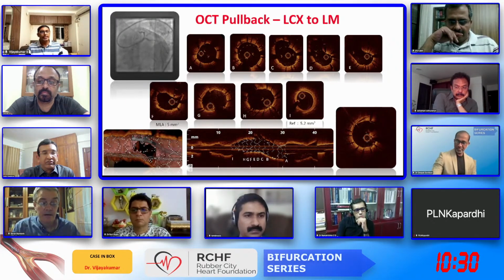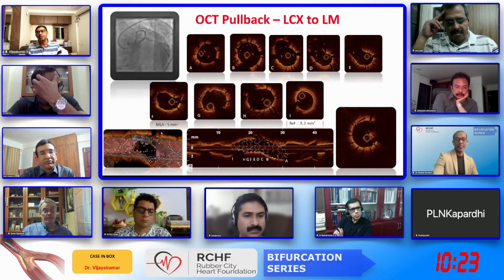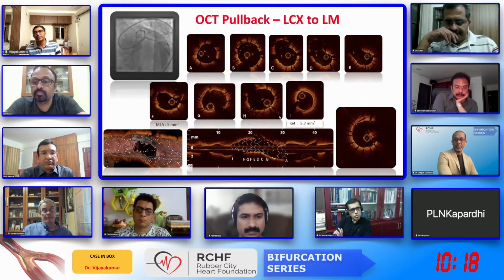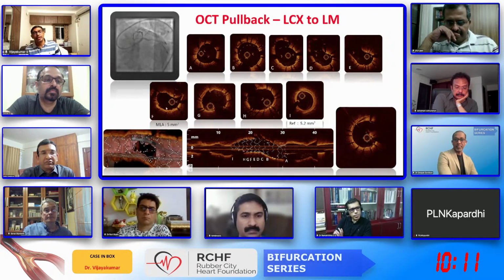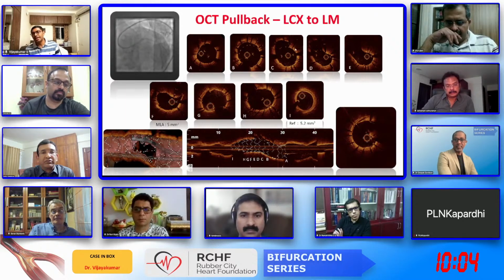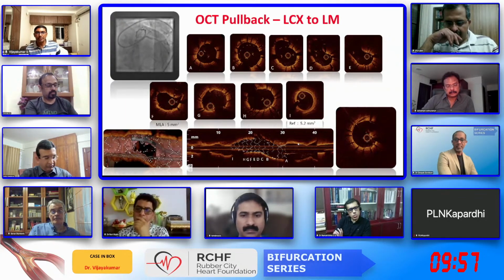Yeah. Another risk here is that I'm in no way going to compress this one further. I'll be expanding on the other side. There is some possibility of even rupturing your vessel. This is a situation where you get a reasonable amount of expansion, so just don't overdo things and end up rupturing this area, which is the most difficult situation to deal with. Once you're sure with a reasonable amount of expansion, you're done, and you always end up with some malposition because this calcium doesn't allow you to go to the vessel wall at all. It's okay, and we have only 10 more minutes. I'll proceed further if you're okay.